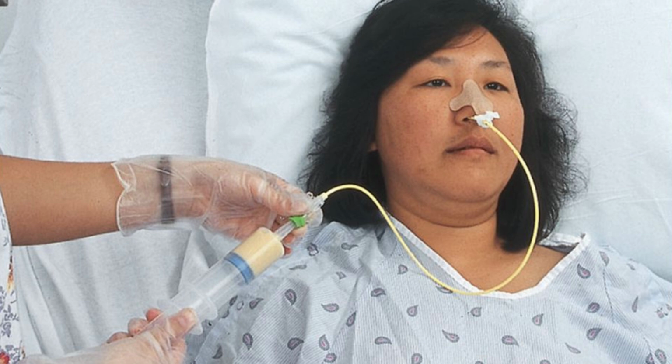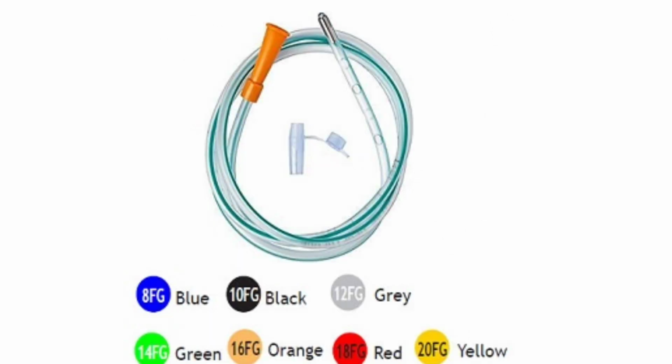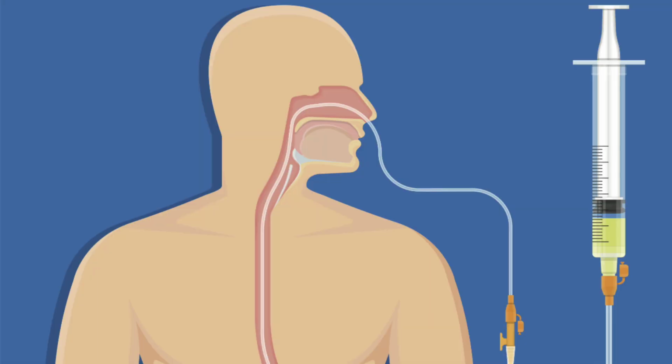How to give the feed to the patient through the nasogastric tube. Nasogastric tube, other name is Ryle's tube. Naso means nose, gastric means stomach. Through the nose to stomach, we are inserting the tube, so food material directly enters the stomach. Through this process, we are giving the feed to the patient. Here we are seeing the definition, purpose, indication, articles, and finally the procedure.